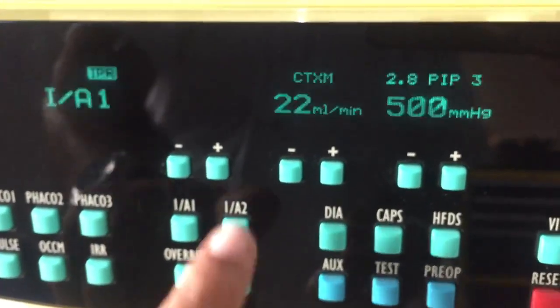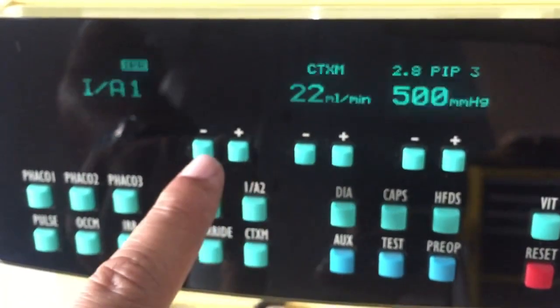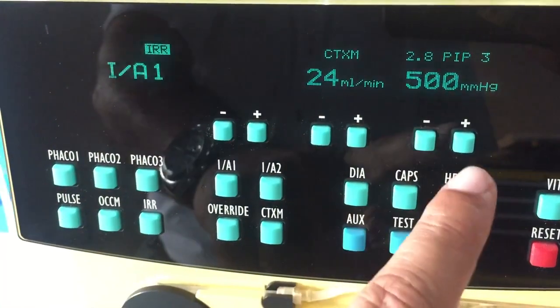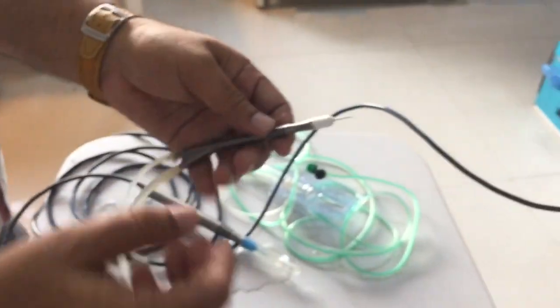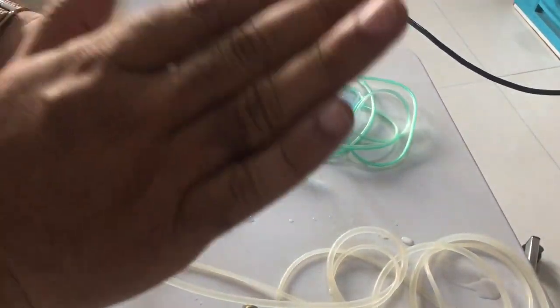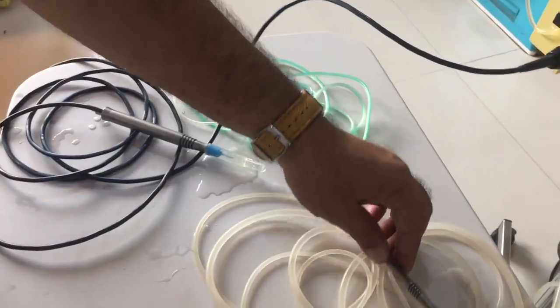You can also press the CTX mode, and here are the settings for the I&A. It is ranging, you can select from 22 to 23 or 24 like this, and then 500 vacuum for the I&A. So you will activate the I&A mode by foot switch. First step is irrigation, then second is the vacuum occlusion, and the third one is the aspiration. So you can do it in this way.